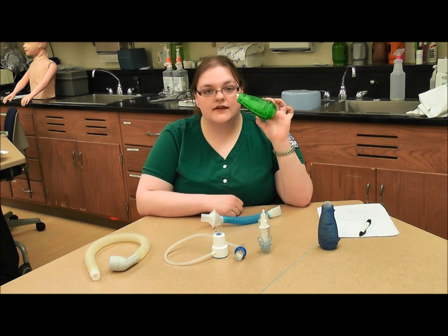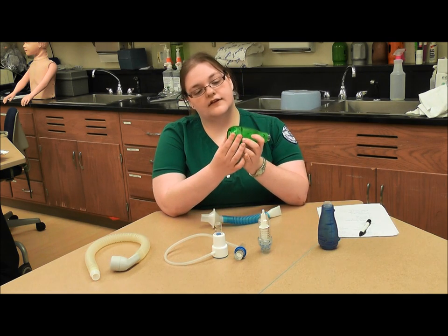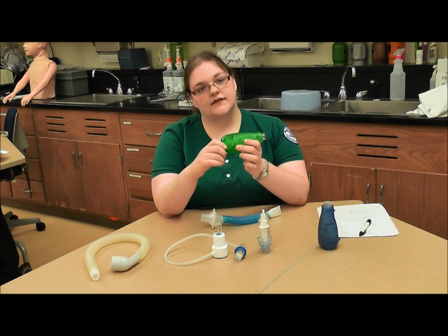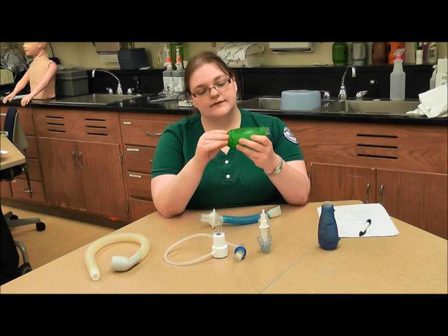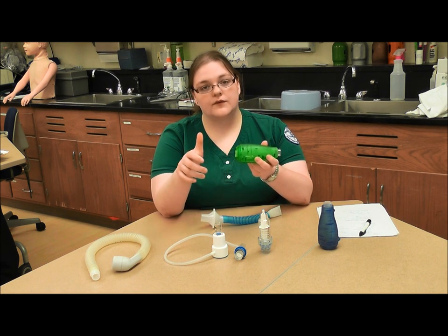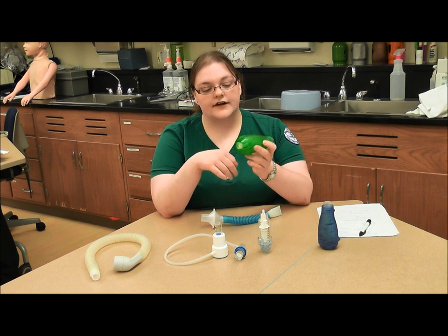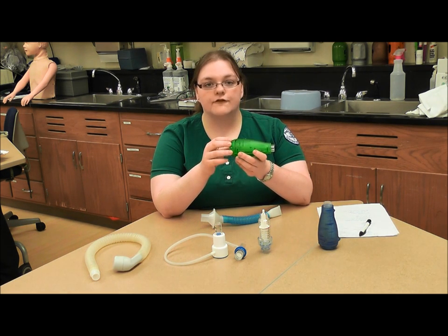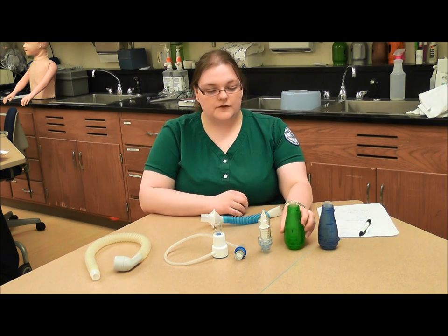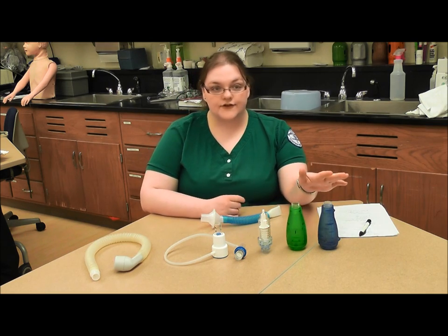The modern versions are these two. We can adjust the difficulty on the setting in the back. If the patient is extremely weak, we put it on a low setting, and if they're really strong or maybe a larger person with bigger lung volumes, we'll put it on a higher setting — whatever the patient is most comfortable with at a therapeutic level. The same applies to all of these; you're aiming for a therapeutic level that is good for the patient.